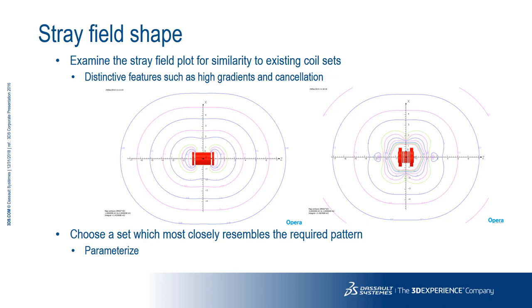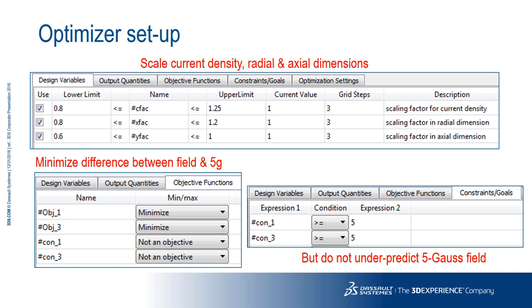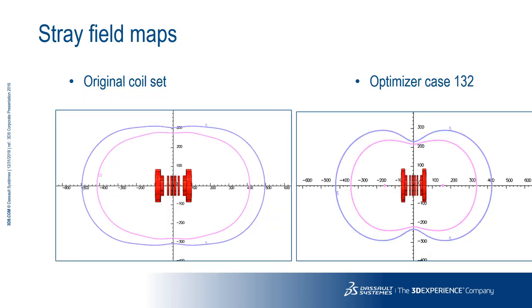We know from the measured stray field map where the 5 gauss line intercepts the axes, so we set up different objectives based on those axial values. For this example we have three variables: the scaling factors applied to the current density, the radial dimension, and the axial dimension. Customers have used many more variables in real examples, with coil cross-sections and individual dimensions being varied. We have two objectives: to minimize the difference between the calculated stray field at the crossing points and the desired value of 5 gauss. We set constraints to make sure the field is at least 5 gauss for a factor of safety. From this, the optimizer produces a set of designs that meet the constraints. Here we see what the optimizer has done to the original coil set — the coils have mainly been scaled in the axial direction, and you can now see the very pronounced dip in the field on the center line as seen in our measured stray field map. Coil design 132 is now suitable to use in our shield calculations.